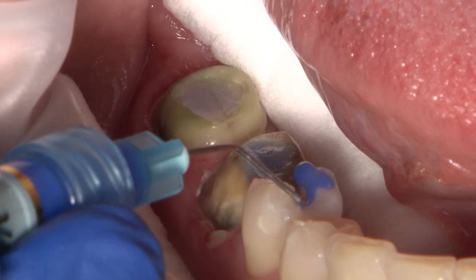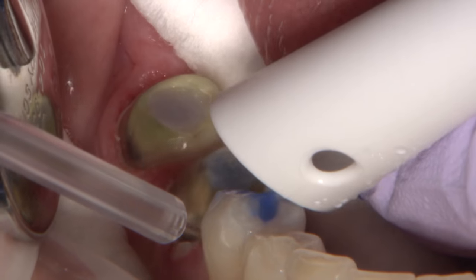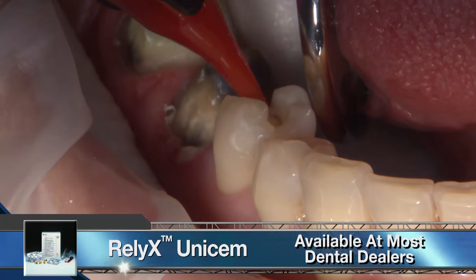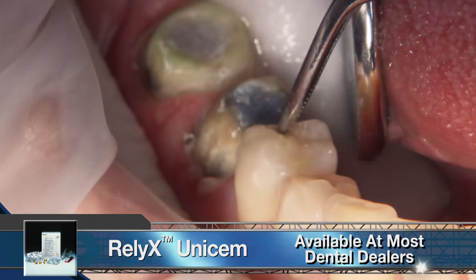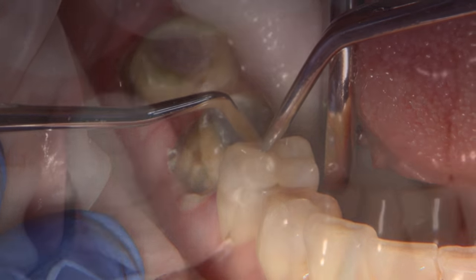After preps were clean and dry, I apply phosphoric acid to the cavity preparation of number 29, rinse, dry, and bond. And then use Relyx Unicem into the cavity and insert the inlay into place. I make sure the inlay is fully seated and free of excess before curing.